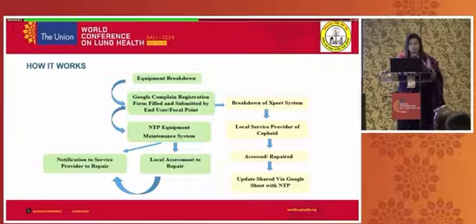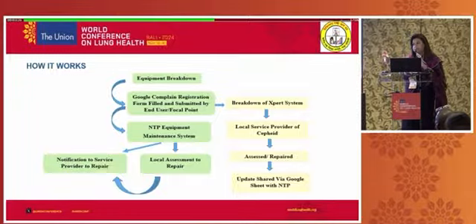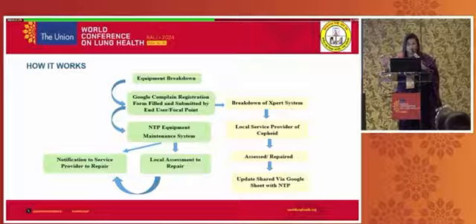For the equipment for which we don't have any specific service provider, these complaints are registered in the NTP equipment maintenance system, which is monitored by our biomedical engineer team. They do a local assessment of whether the machine could be repaired locally or not. If not, then they go to the service provider for the repair. Here, our NTP and our implementing partner, BRAC, work together to get it resolved.